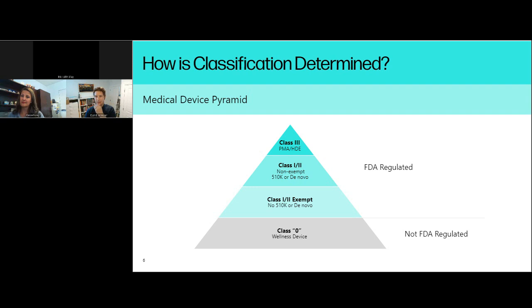So it still follows, again, ASTM and ISO standards that are specific to the type of device. For instance, if we talk about a spinal cage or IBFD device, that is ASTM 2077 and ASTM 2267. Those are the specific standards. So all the testing for characterization, whether it's patient-specific or just a general product line, is going to follow those specific test standards. The difference is that we may test multiple sizes when it's additive to make sure that every combination of geometry, volume, and footprint of the device still represents a safe and effective device per the indications of use.